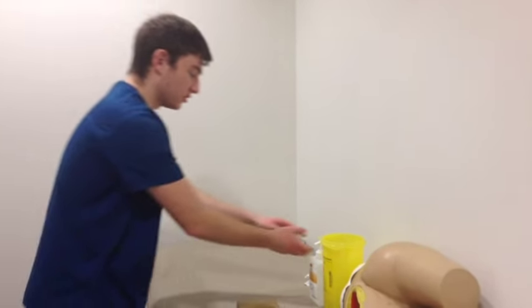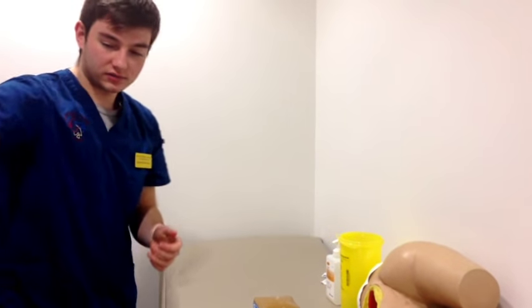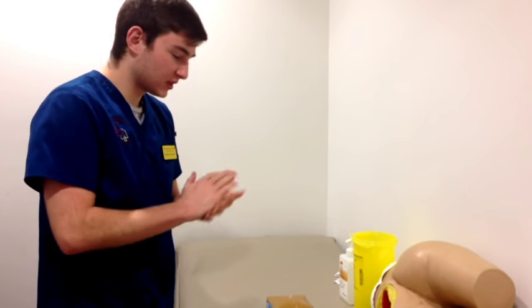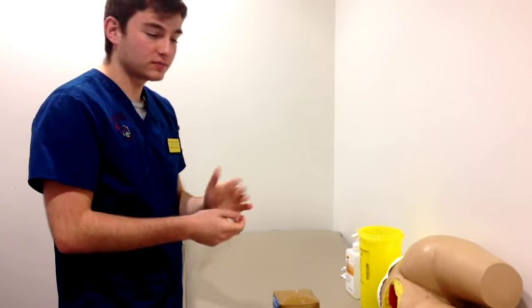Alright, so now we're going to be injecting the medication to the patient. First off, I'm going to draw the curtain to ensure privacy. I'm going to introduce myself to the patient, and I'm then going to inform him about the medication. So here we're going to be doing intramuscular injection of Haldol.